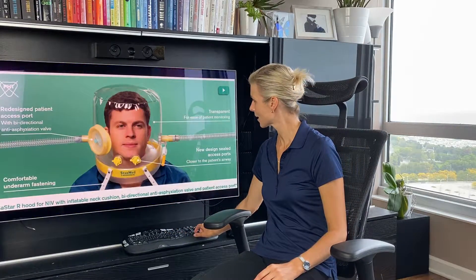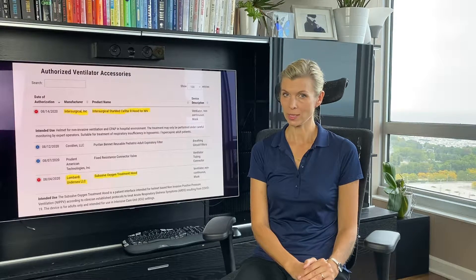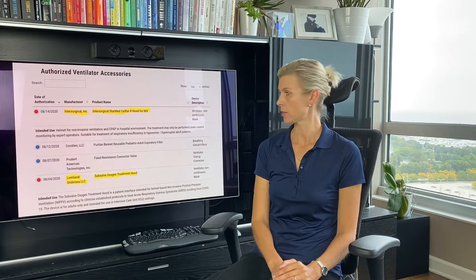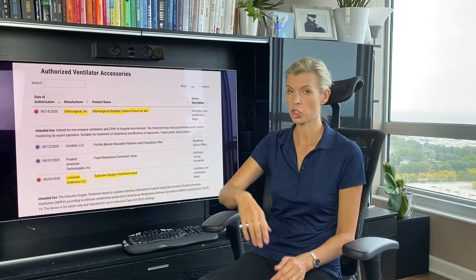My name is Aurika Savitskayeta, and I'm a co-founder of HelmetBasedVentilation.com. In this video I will show you a helmet made by Italian company StarMed. Intersurgical is the company that will be distributing this helmet in the U.S., and they received FDA EUA approval back in August. So now in the U.S. we have two helmets that got that approval — it's the StarMed CaStar R hood for NIV and Subsalve Oxygen Treatment hood.